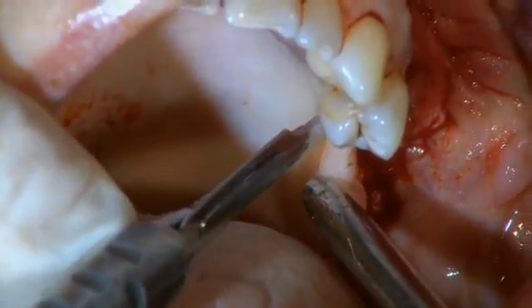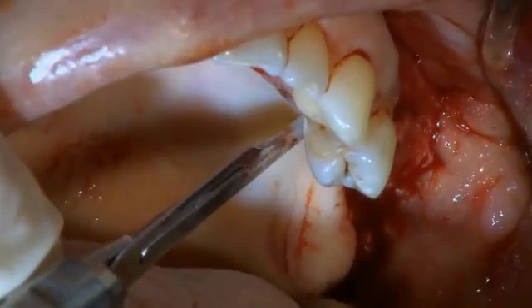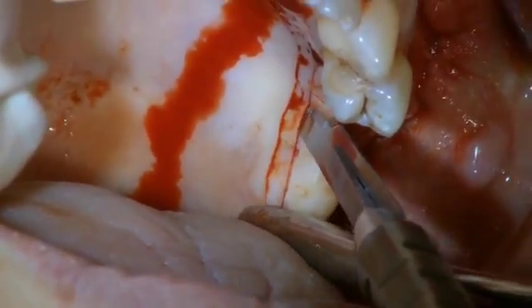Now we harvest a strip gingival autograft from the palate. It has a width of about 2.5 millimeters and a length of several centimeters to connect the most mesial to the distal points.